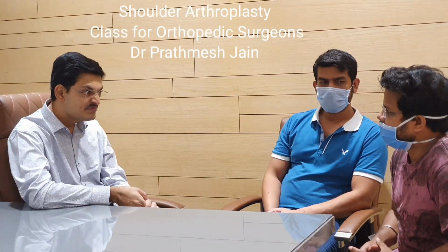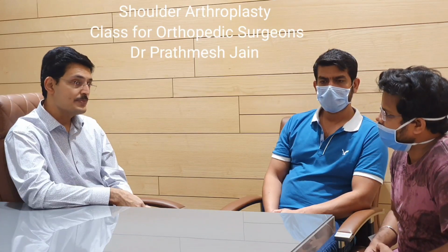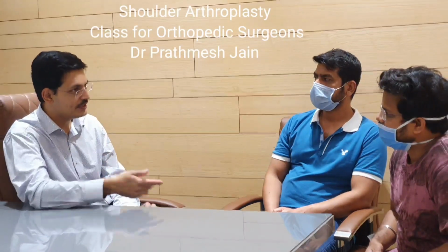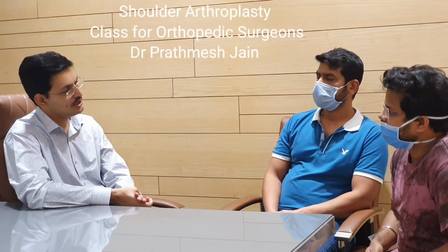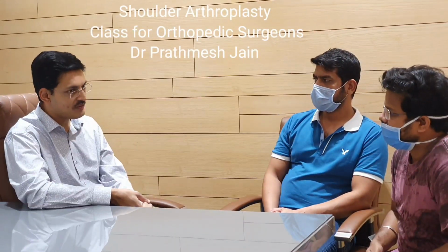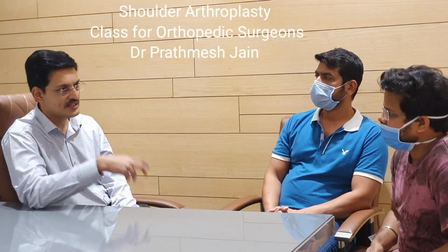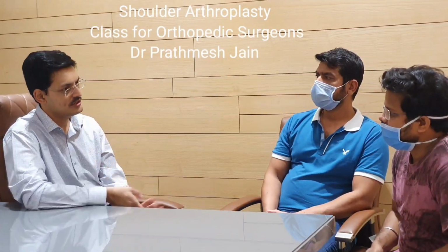Can the patient do heavy work? Yes, the patient can do heavy work. Some of our patients are sportsmen also. We have done a patient who was a merchant navy officer, and he went back to his work of driving ships and all. So he can do heavy work also. The longevity is not very well tested at present, but we can say it is around 10 to 15 years usually. With this unsymmetric prosthesis, it is a better longevity as compared to the older generation.